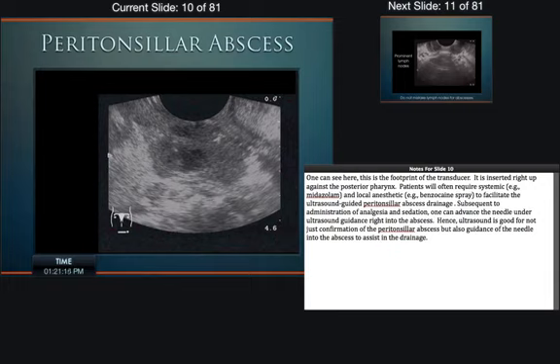So we can localize these things. If they're small abscesses, we can get to it with a needle and just aspirate the pus back into the needle. Other times, though, we need to take a scalpel and an 11 blade and slice it open and let the pus drain out in the back of the throat. And right away, you're wondering, what do you do with all that pus? It's kind of gross. It's draining down into the esophagus, or worse, it could go into the trachea.